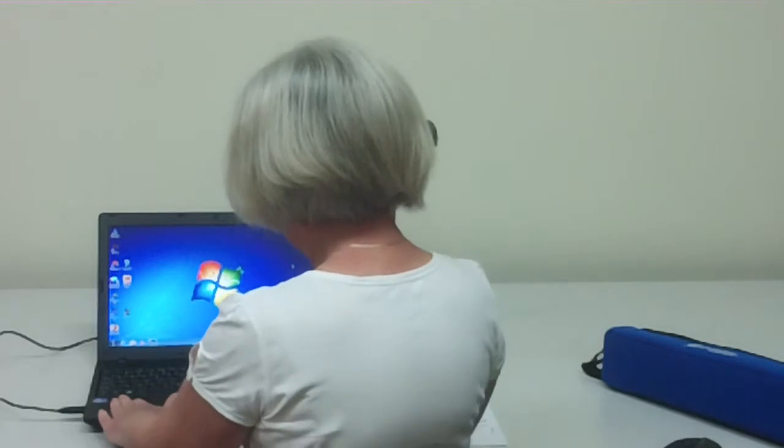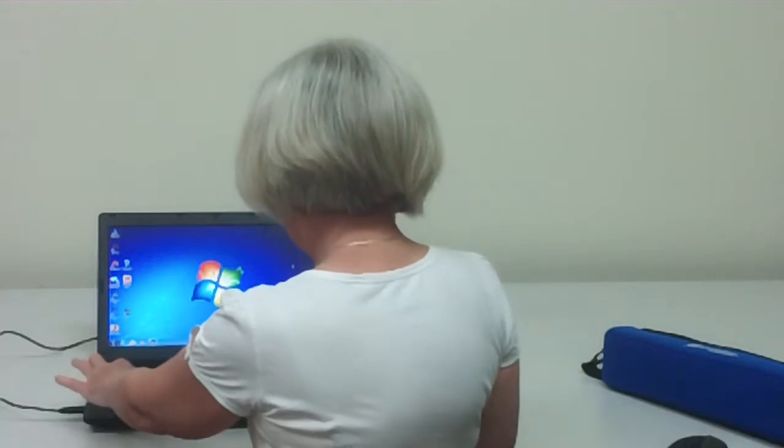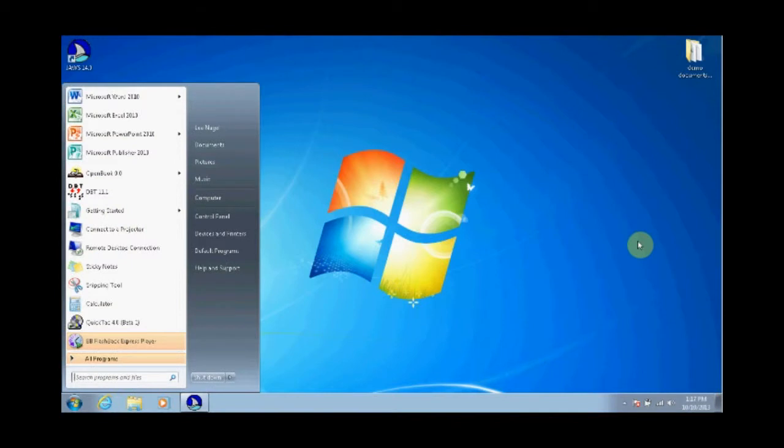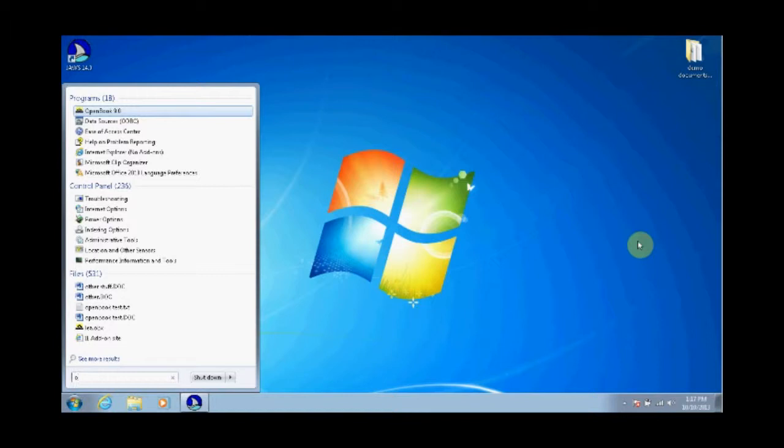The student would then go to their computer. I've got JAWS running on it, which is likely what the student will be doing. Press the Windows key to get the start menu up. This is Windows 7 so I've got the search box — you have to adjust this according to what system you've got. Start typing 'Open Book' — all I had to do was type O until Open Book 9.0 becomes the top choice, then press Enter.